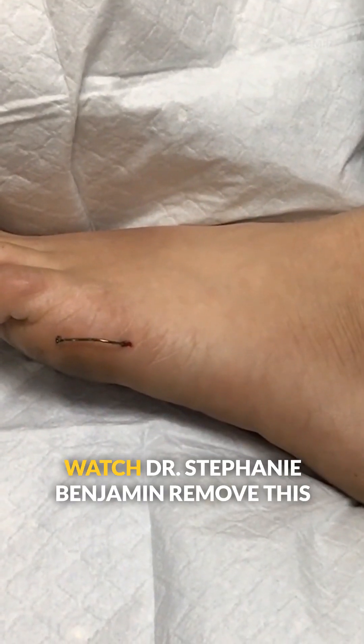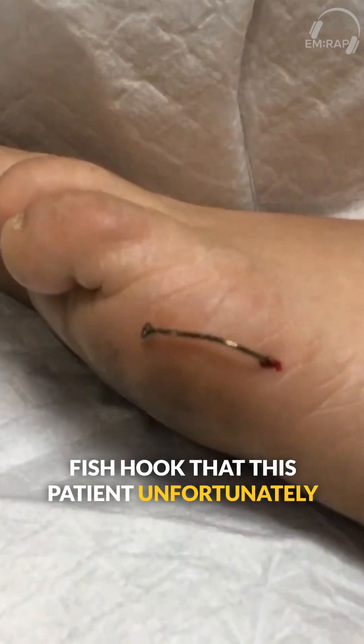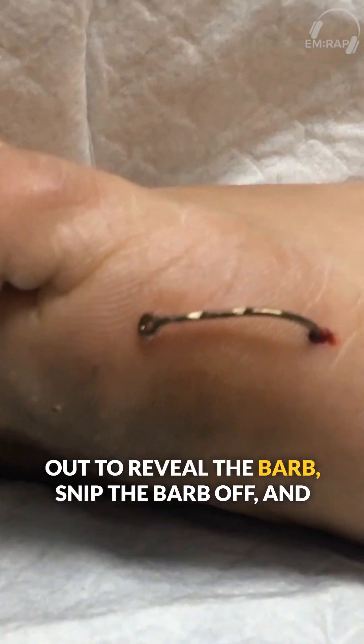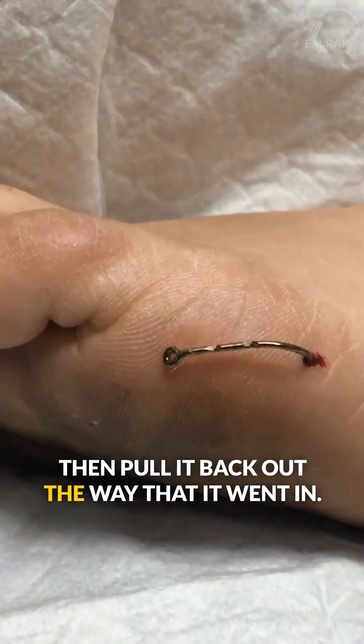I'm Dr. Jess Mason, and we're going to watch Dr. Stephanie Benjamin remove this fish hook that this patient unfortunately stepped on. There are a few ways to do this. Our basic approach for this one is to push it out to reveal the barb, snip the barb off, and then pull it back out the way that it went in.